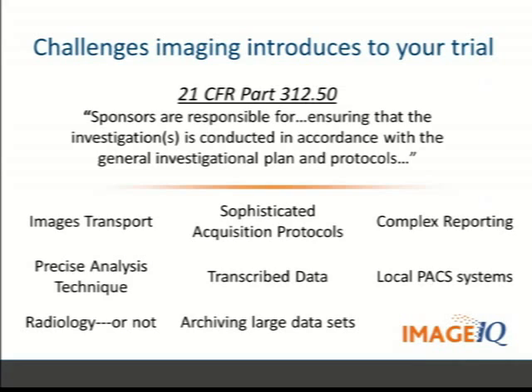So when you look at your images and you look at the data that goes with the images, you remember what you're looking at, and everybody's doing the same thing because you're trying to remove that variability, right? And I know that's something you guys measure on a regular basis. And then putting QA exercises on top of that to make sure that we are doing that properly.